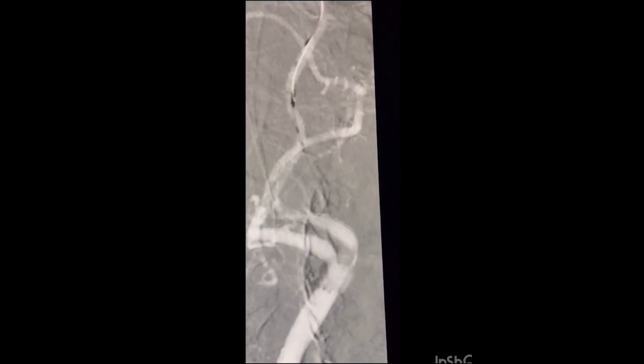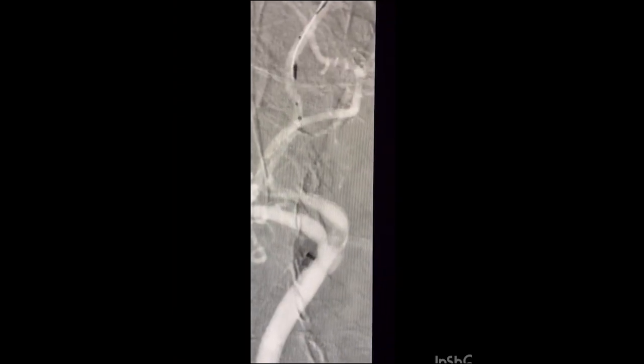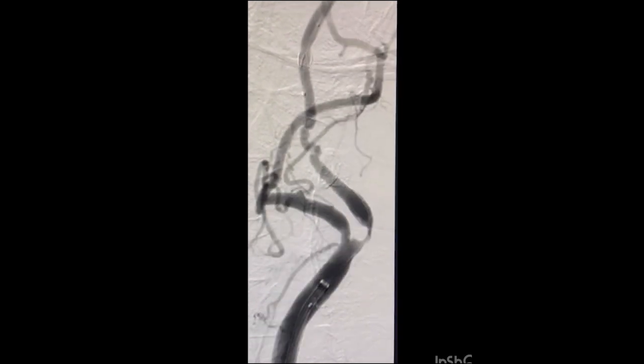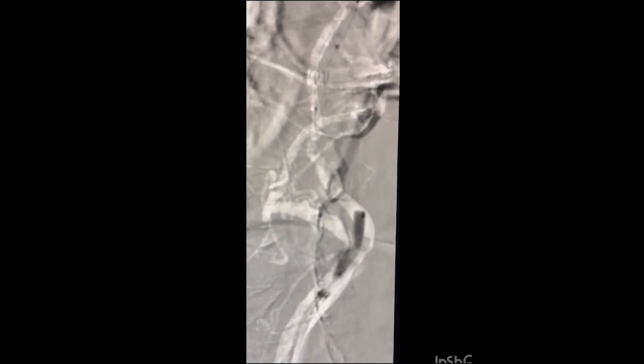up. Note that once the filter had been taken distally, the entire internal carotid artery had straightened up. The run taken post navigation of the filter showed kinking of the internal carotid artery due to the straightening of the vessel. Thereafter, a 3 mm balloon angioplasty was performed.